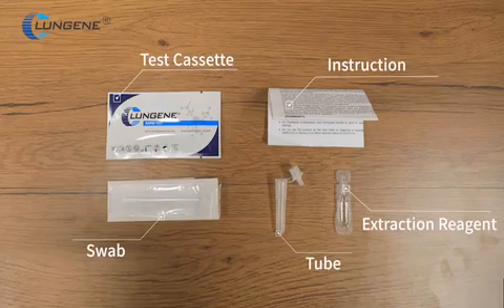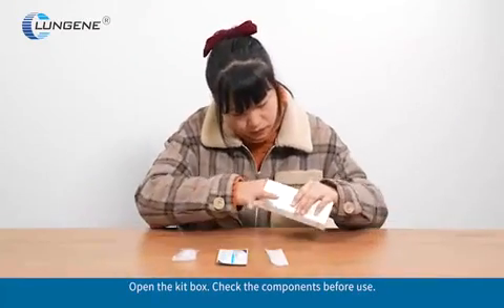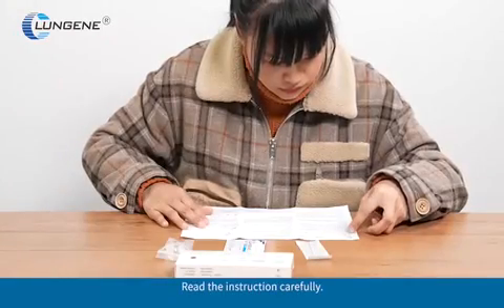COVID-19 Antigen Rapid Test Self-Testing Test Procedure. Open the kit box. Check the components before use. Read the instructions carefully.